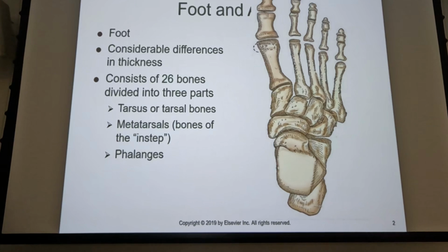What you may see all the way through the registry test questions is reference to different types of filters, and the only real filter that we've talked about so far has been inherent filtration, but there is such a thing as additive filtration.